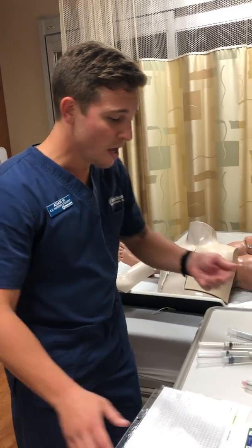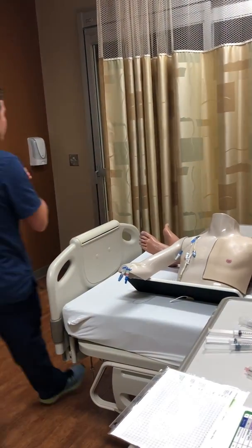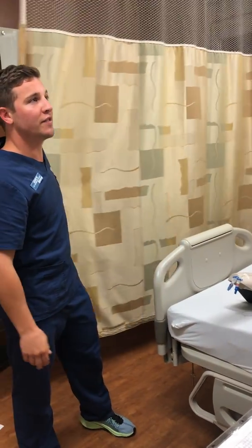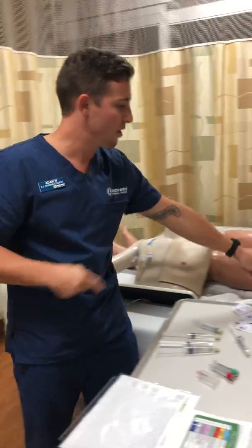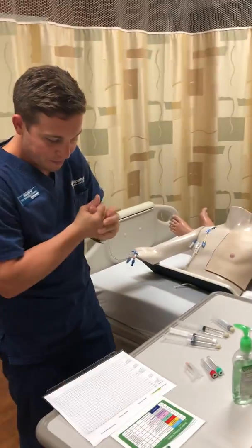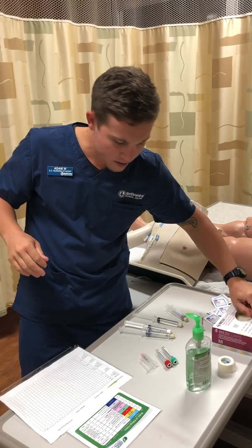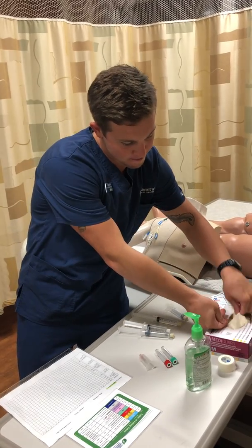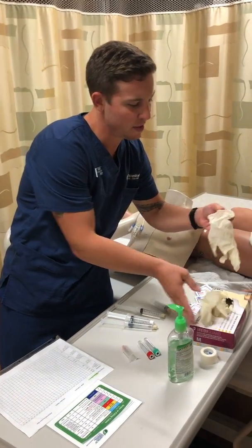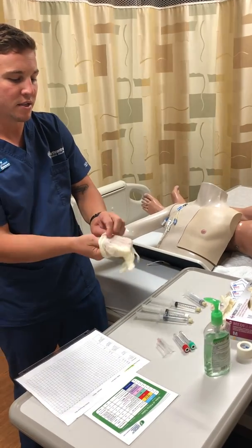Alright, so I'm going to give us a little bit of privacy here. Jennifer, could you give me your full name and date of birth, please? She tells me 11/5/1975. And so I'm going to check out on her hand here, and that checks out. So that looks good. I'd be assessing her, also making sure that she is able to follow commands during this as well. She's able to follow commands.